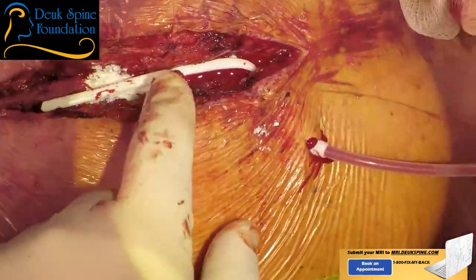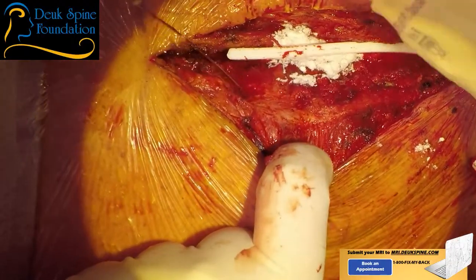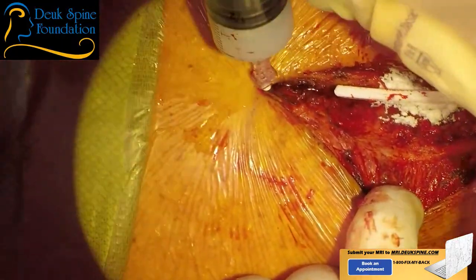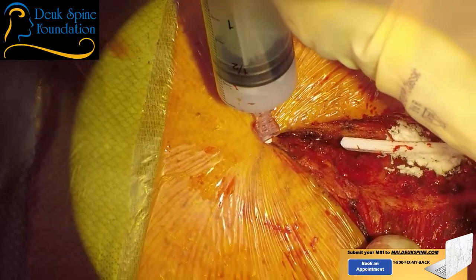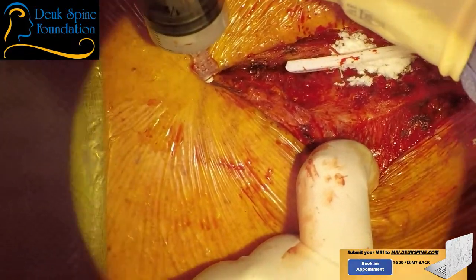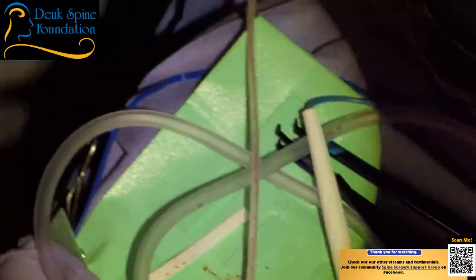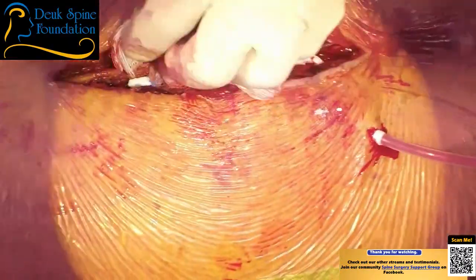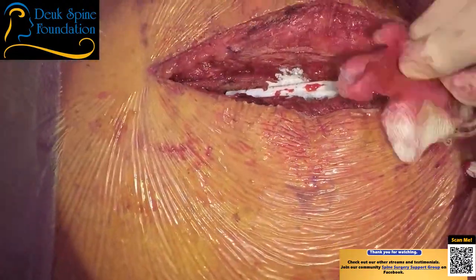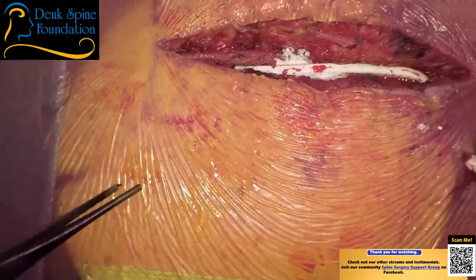Is that the latest blood pressure? Okay, get a Raytec. At the end, you want it normal, right? No, in the recovery, I want it low. Oh, you want it low? I want it 100, 105, at most 110. We don't want him to develop a hematoma. Eventually we can start bringing it up, but I don't want him hitting 150, 160.